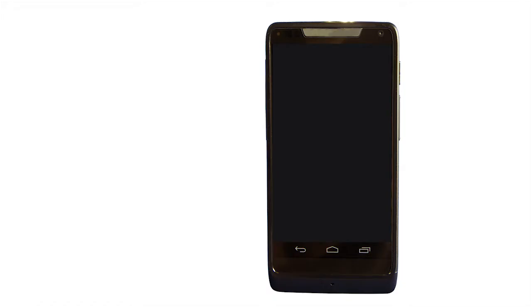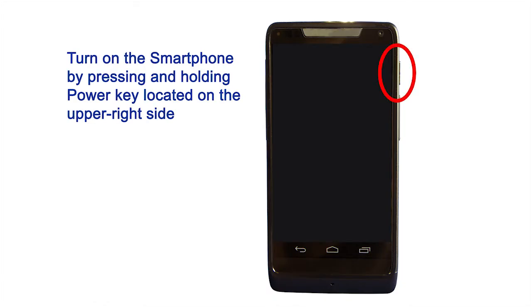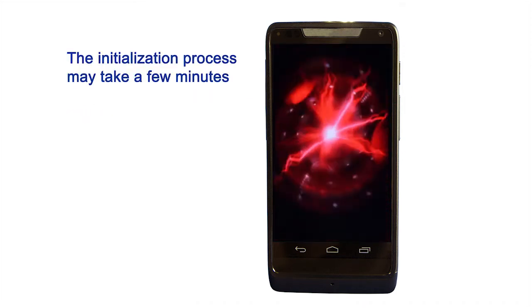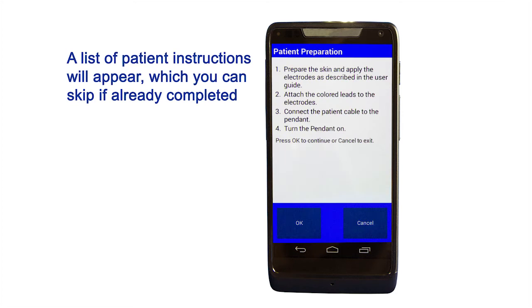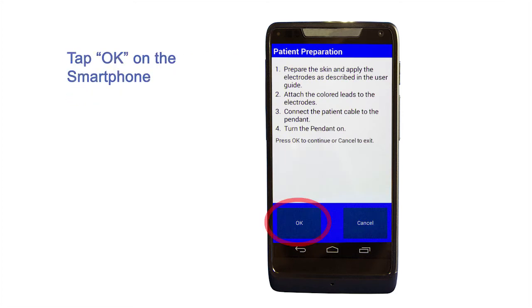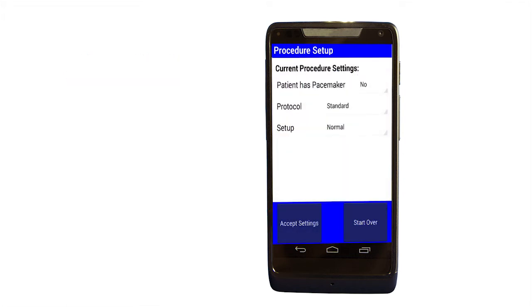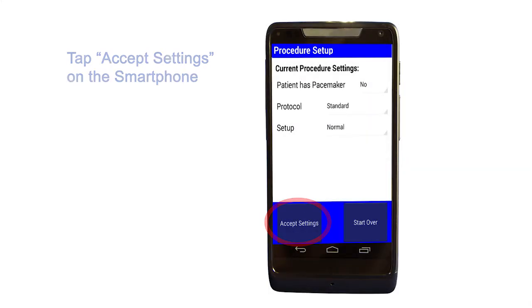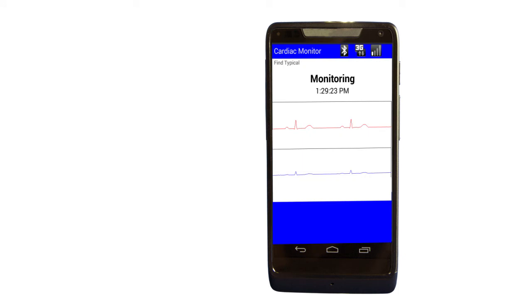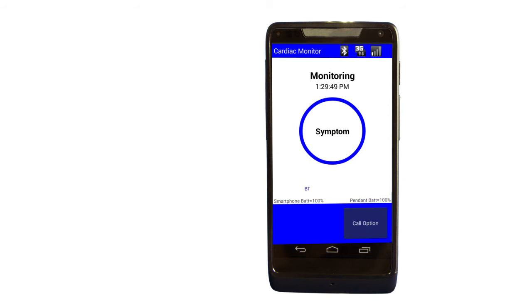Starting the smartphone: turn it on by pressing and holding the power key on the upper right side. Wait for the smartphone to run through its initialization process until the main screen appears, then tap Start Procedure. A list of patient preparation instructions will appear, which you can skip if already completed. Tap OK. The standard settings for an adult are preset into the smartphone. If you have a pacemaker or are connecting a child, please call the Medicomp Cardiac Monitoring Center at the phone number on the back of the pendant. Tap Accept Settings to continue. The monitor will finish initializing and acquire your heart's electrical signal. When the handset has recognized your ECG, the waveform will disappear and the screen will display monitoring. Your cardiac monitoring procedure is now running.